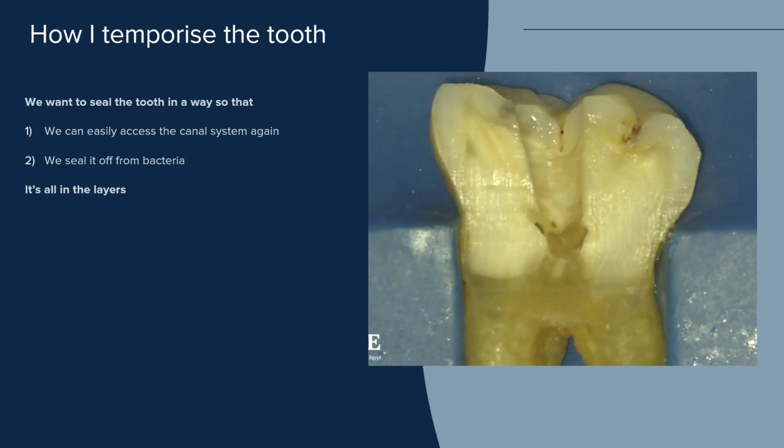So why do we temporize the tooth? Because we want to seal it off so no bacteria can enter the tooth again. It's like saving your progress in a game. So we want to seal the tooth in a way that we can easily access the canals again.